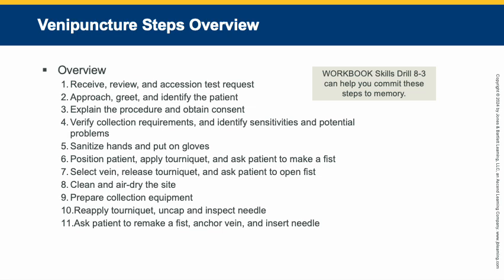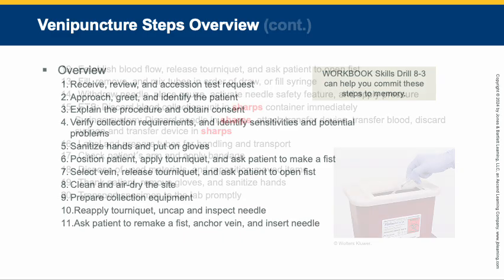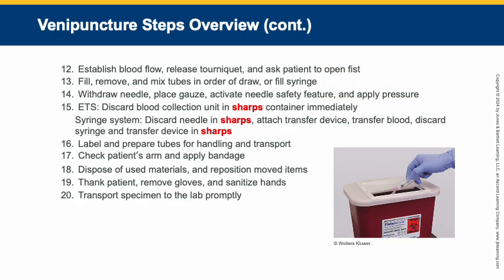You uncap and inspect the needle, like you're looking for any burrs or anything that's wrong with the needle. Ask the patient to remake a fist, anchor the vein, and insert the needle. You're going to establish blood flow.